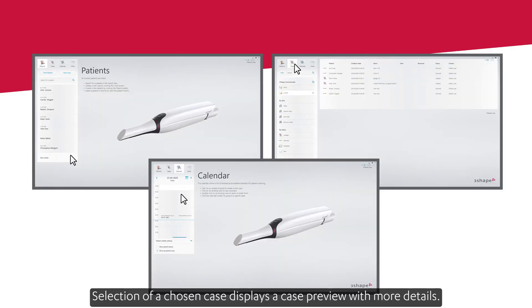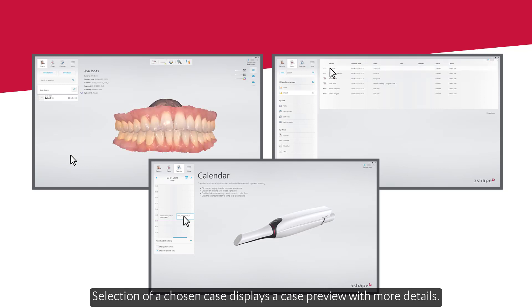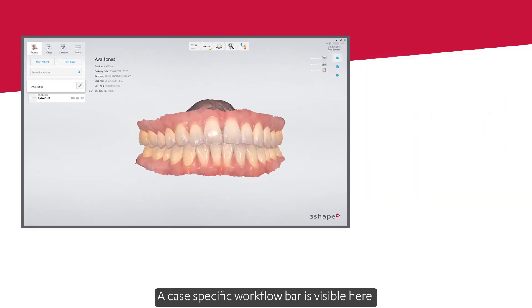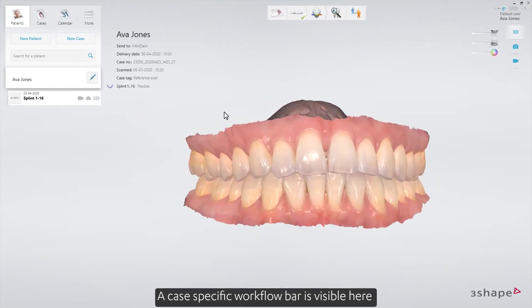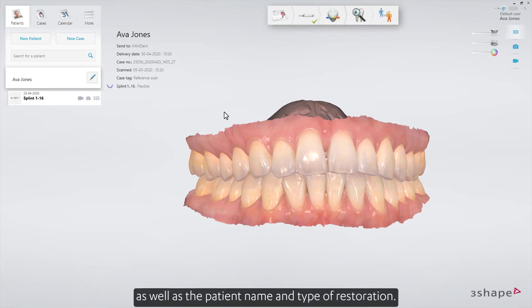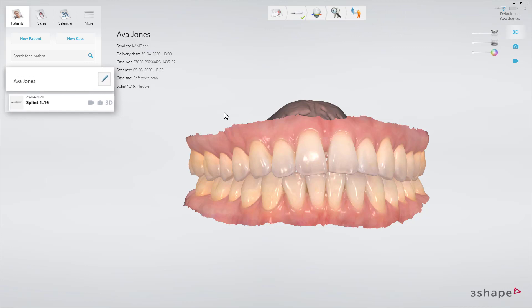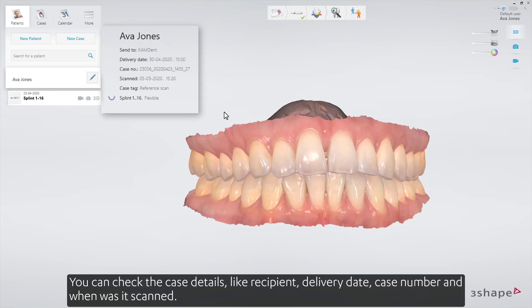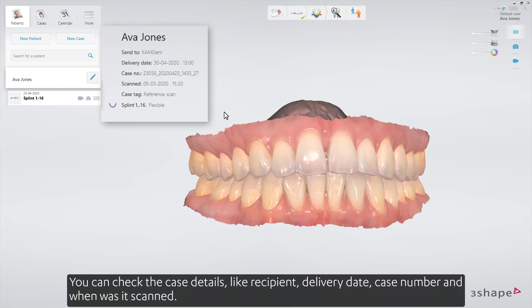Selection of the chosen case displays a case preview with more details. A case-specific workflow bar is visible here, as well as the patient name and type of restoration. You can check the case details like the recipient, delivery date, case number, and when it was scanned.